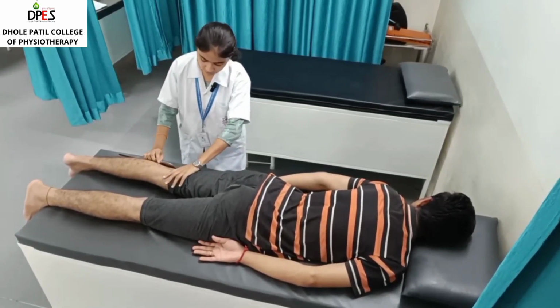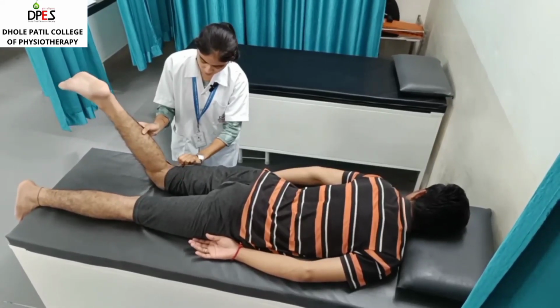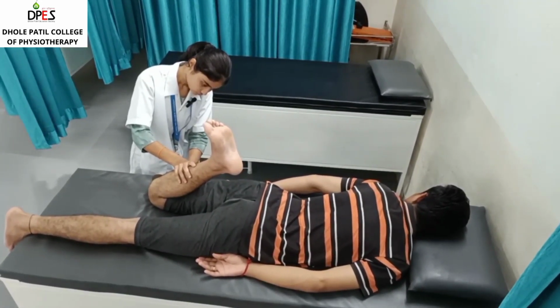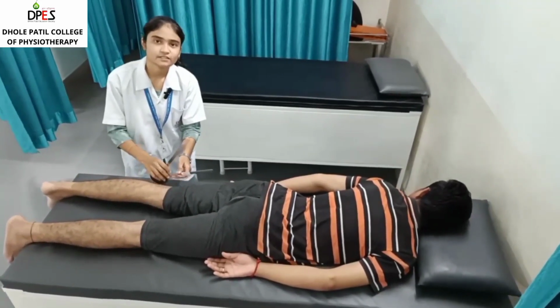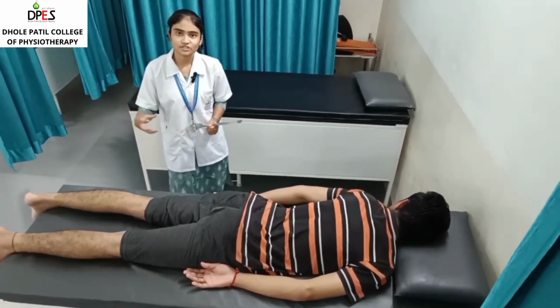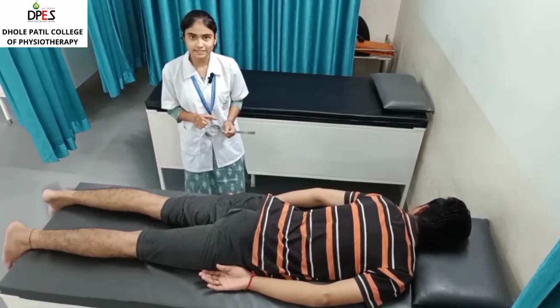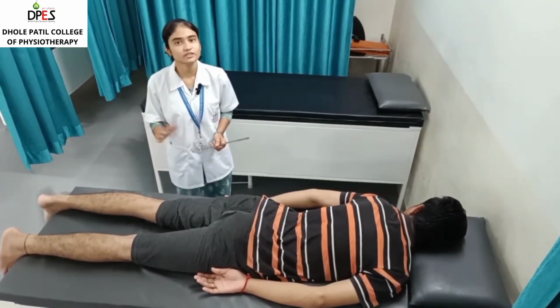Now you have to flex your knees, sir. Now here I get the soft end feel. Firstly he had done actively, and then I confirmed it by applying pressure, doing the passive movement, and the range of motion is 140 degrees, as the normal range of motion is between 120 degrees to 150 degrees. Henceforth the patient is normal, having the full range of motion.